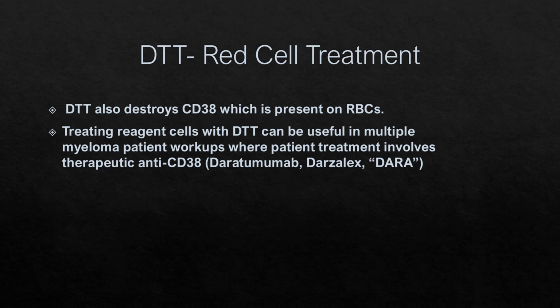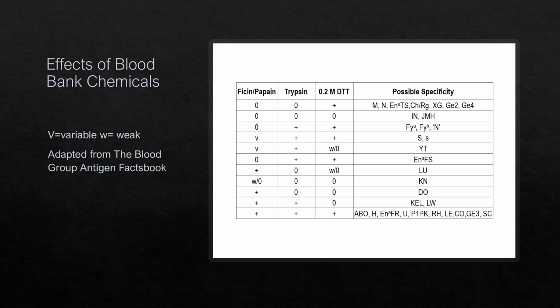This is a very helpful chart if you have an antibody that's reacting in a way and you can't really pinpoint what's going on. You can use these different methods and then kind of narrow down what your options could be.